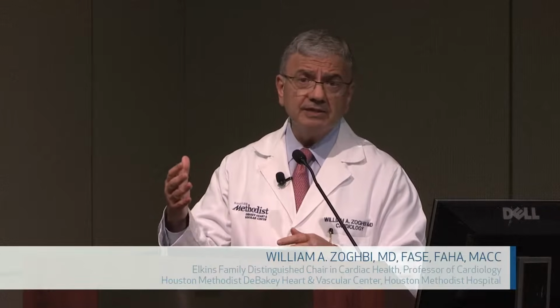Part of the reason is what you see enhanced is the interface between blood and the trabeculations of the heart. Interestingly enough, if you go 1 or 2 millimeters further into the trabeculations, you think it's small, but actually it increases volume conceivably, depending on the size, from 20, 30 cc's to at times 60 or 70 cc's.